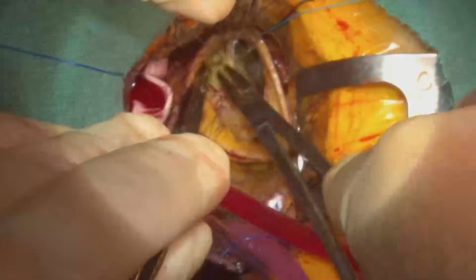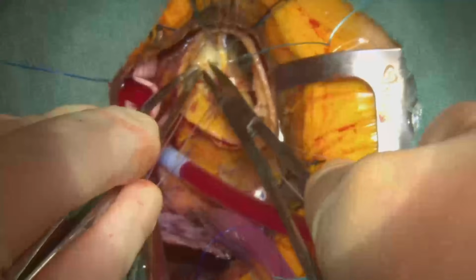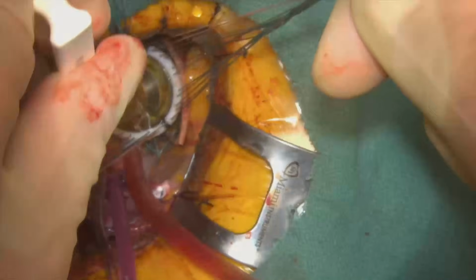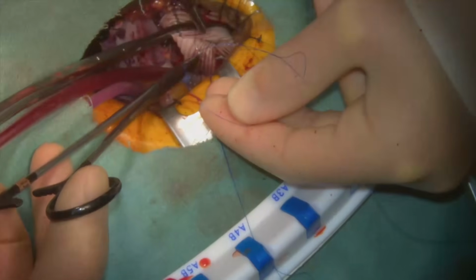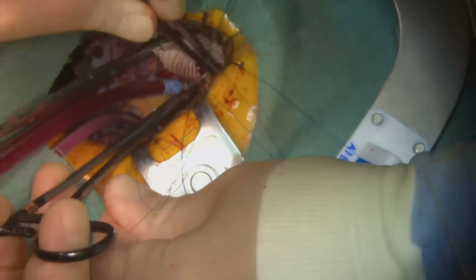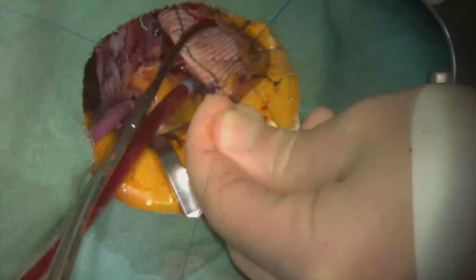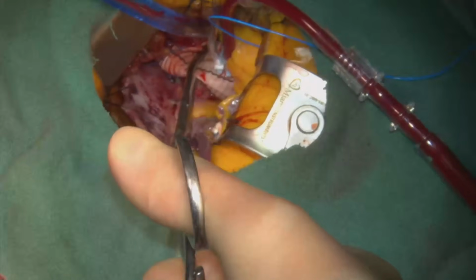Pledgeted valve stitches were used for the aortic valve. The valve was then brought down and secured with a core knot. The proximal graft to aorta anastomosis was performed using a 4-0 Prolene in a running fashion. After de-airing, the cross clamp was removed and the heart began to beat spontaneously.